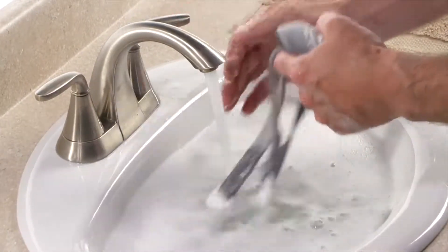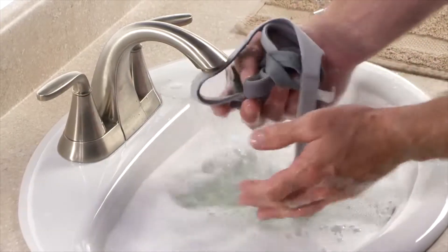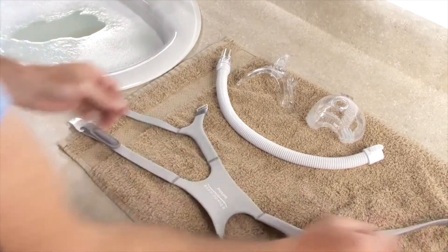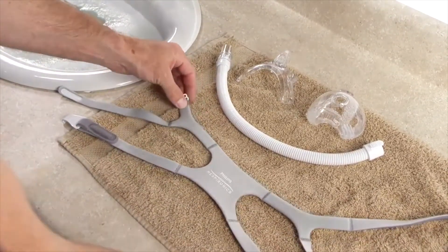Unlike this demonstration, the headgear does not need to be removed for daily cleaning. Lay wet headgear flat or line dry. Do not place the headgear in the dryer.